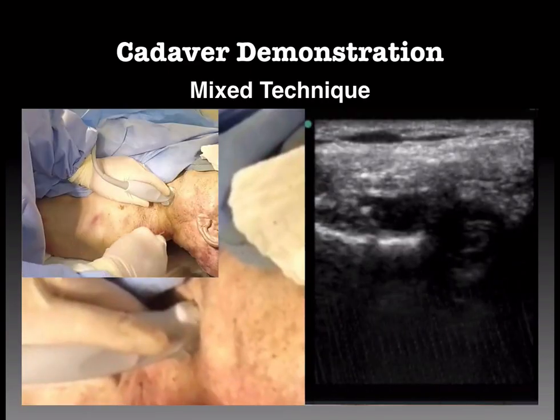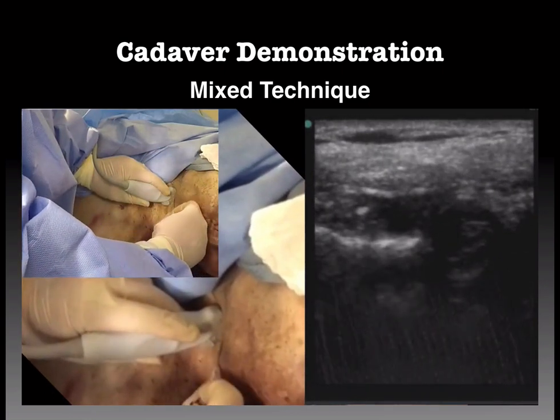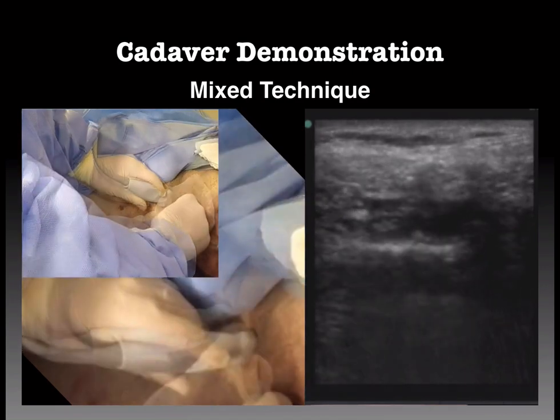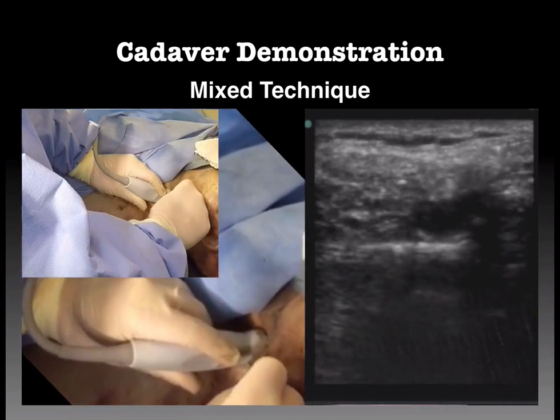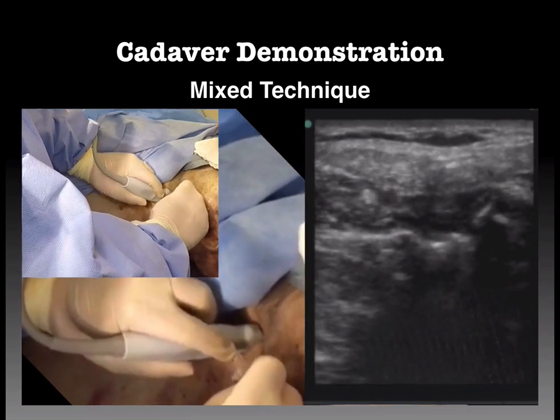Here's what it looks like in a cadaver. We start off in short axis. This is the internal jugular vein. As we're coming down, we can see the needle tip. It's very difficult in this cadaver video, but we see the needle tip. But even though we're close, we don't know exactly where our needle tip is. We know it's pointing to the vein.